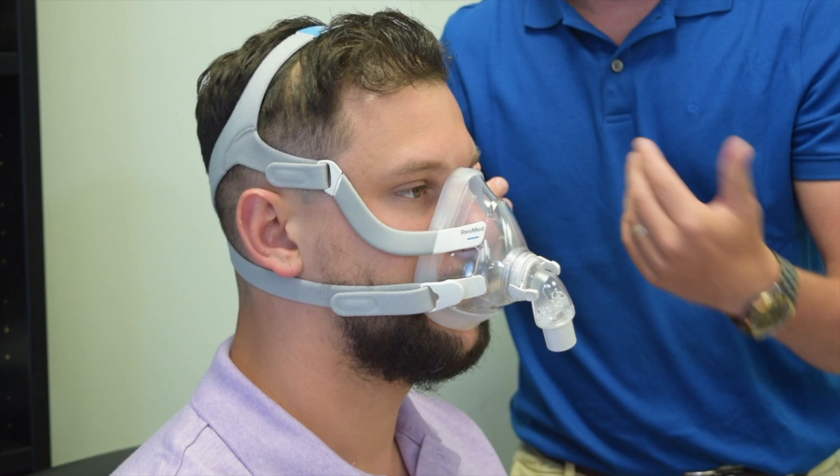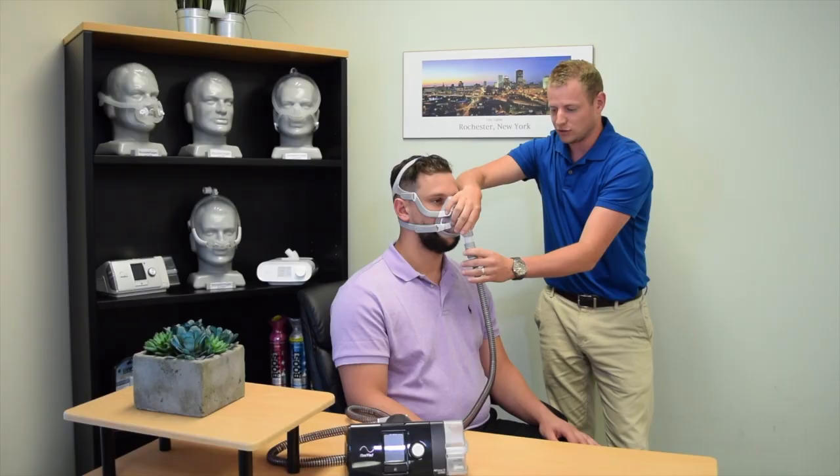Once the mask is secure, you can then connect your CPAP six-foot tubing to the elbow in front.